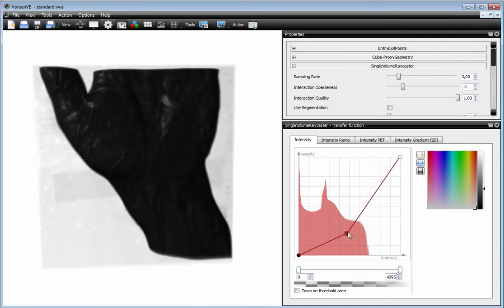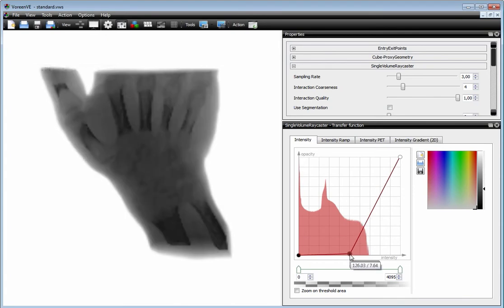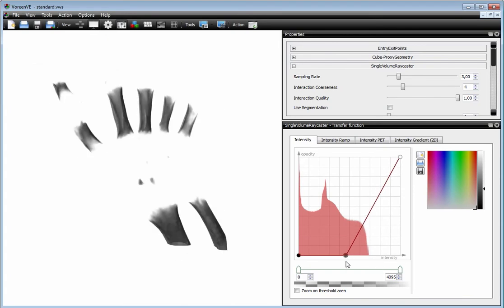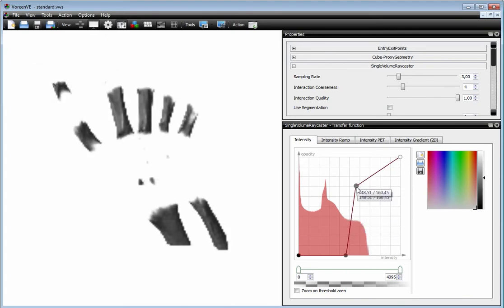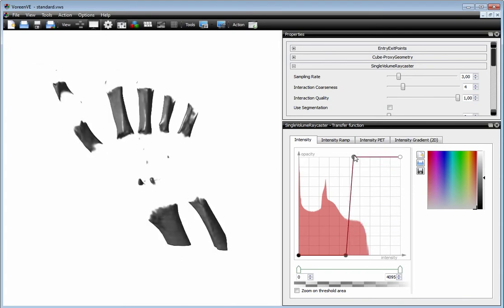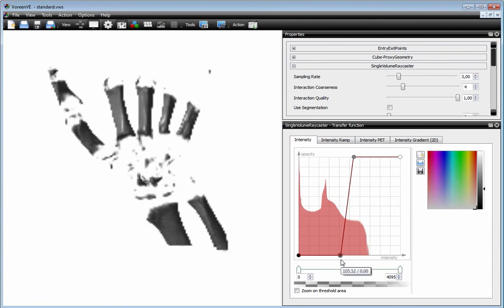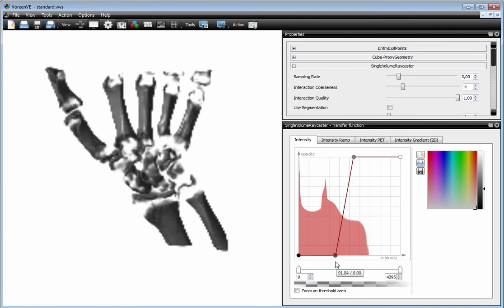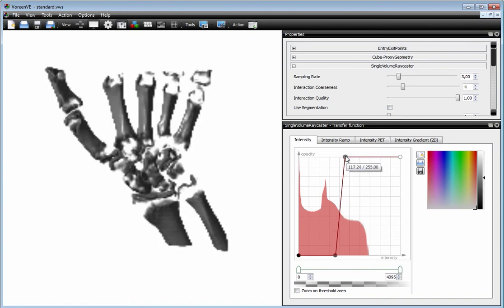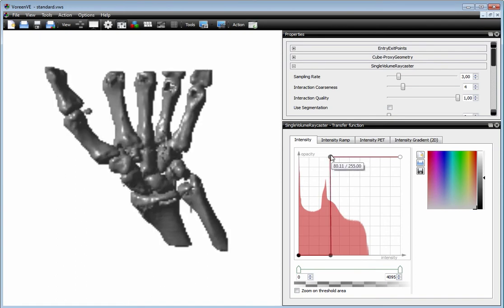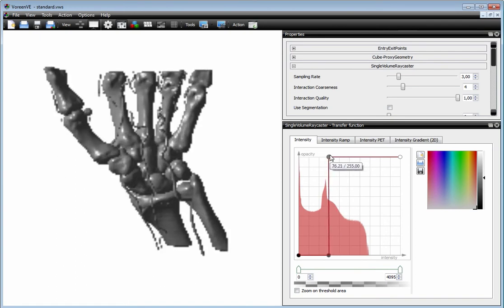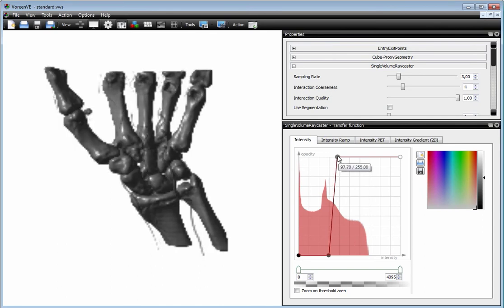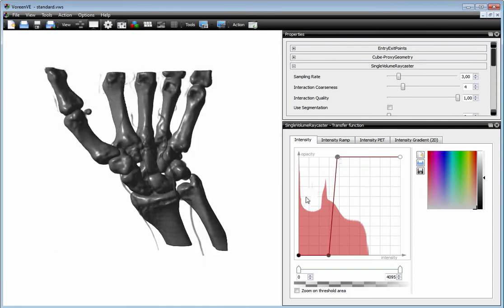Let's try to make the bones of this dataset visible. We just choose the Transfer Function accordingly. So we need a little more here. Okay, so this is the bone structure plus a little bit of the contrast enhanced vessels.